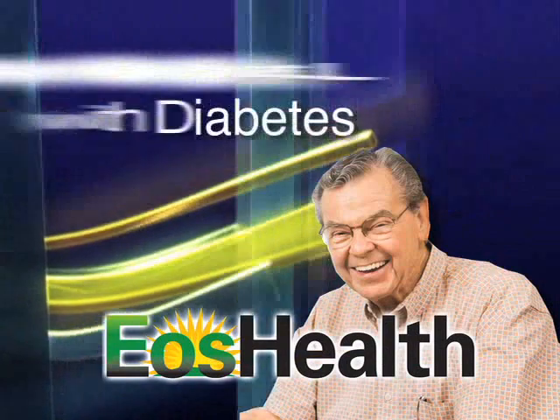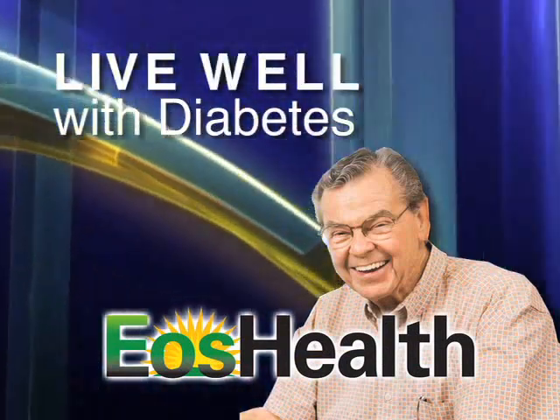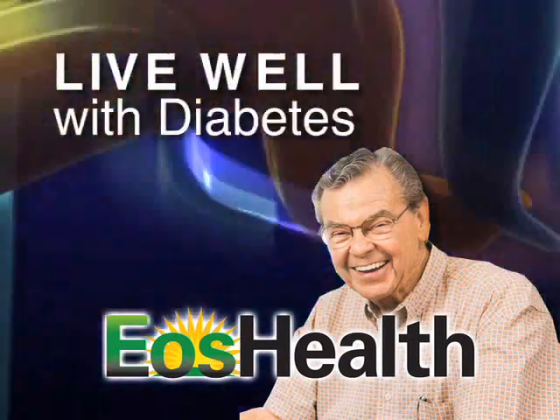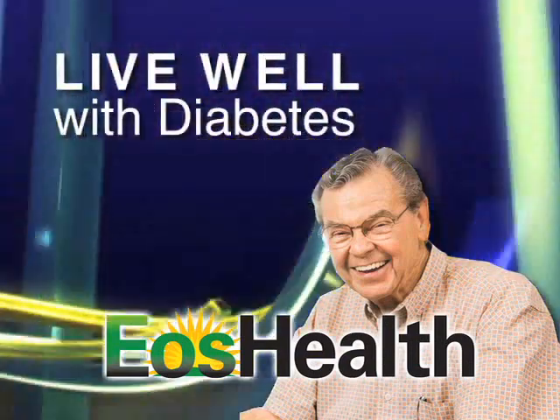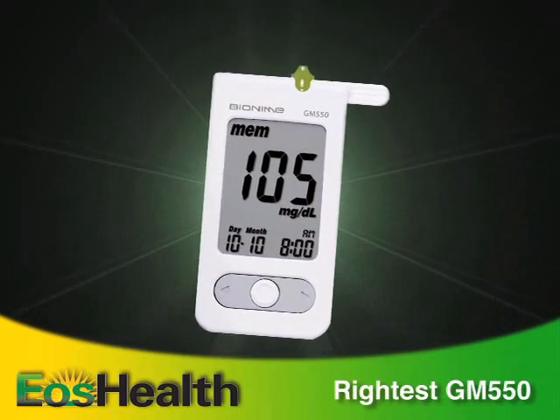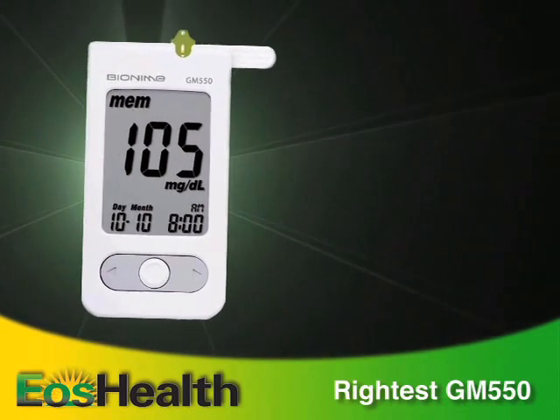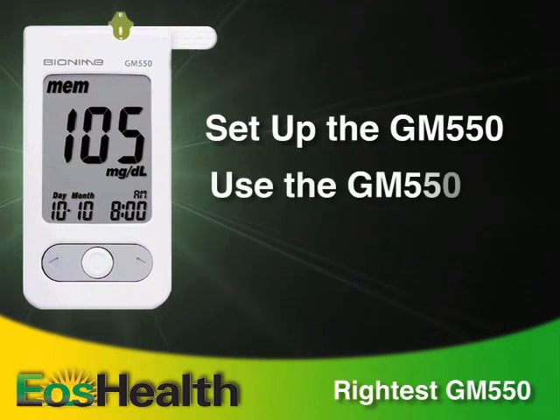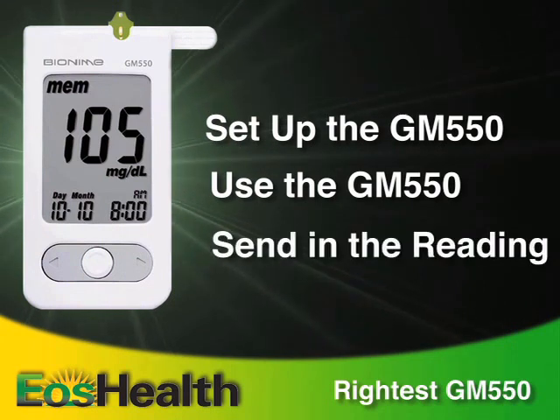EOS Health — helping you live well with diabetes. An important part of managing your diabetes is monitoring your blood glucose on a regular basis. EOS Health has provided a glucose monitor for just that purpose. In this video, we'll show you how to set up and use the GM 550 glucose meter and then send in the meter readings.